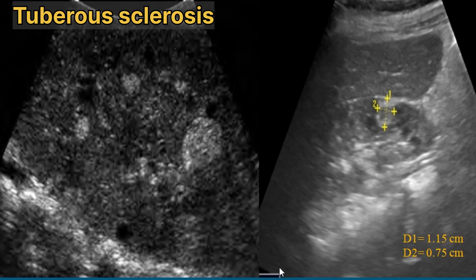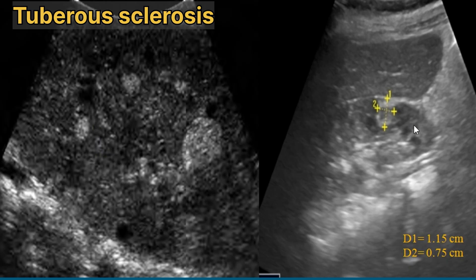Now we will discuss tuberous sclerosis. Tuberous sclerosis is a multi-system disorder associated with the formation of renal cysts and neoplasms. An oblique view of the right kidney shows multiple hyperechoic masses due to multifocal angiomyolipomas. Another sonogram shows a right renal heterogeneous hyperechoic rounded lesion suggestive of angiomyolipomas in tuberous sclerosis.